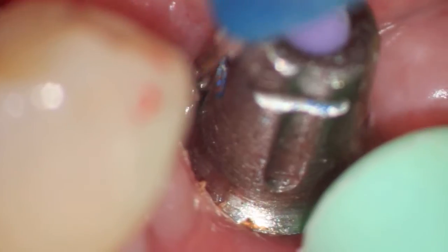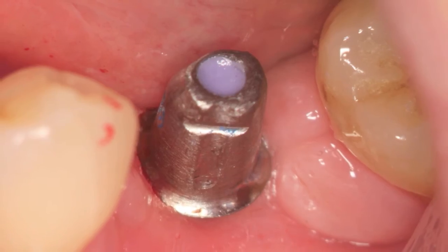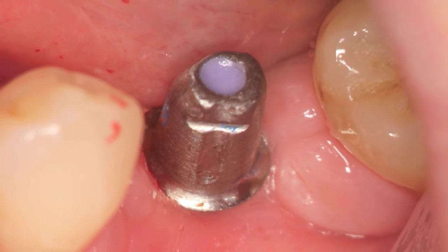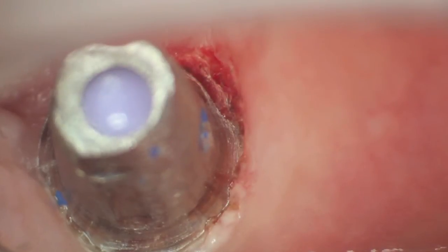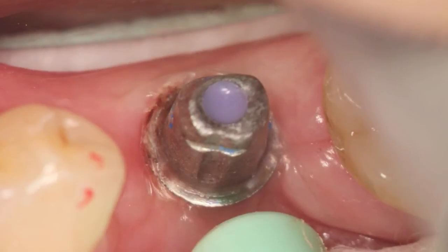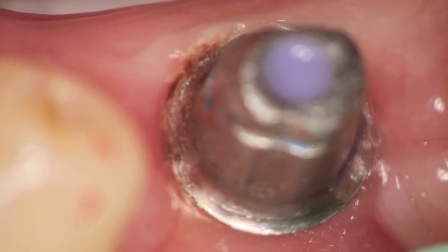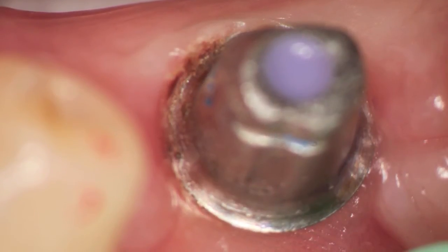At this point, you can clean this up with a little bit of hydrogen peroxide and be able to seat your crown after you've completed the removal of the tissue on the margin. Here it is immediately afterwards with the VPS in the hole, and you can see a clear view of the mesial aspect here of the abutment and how clean the tissue is.